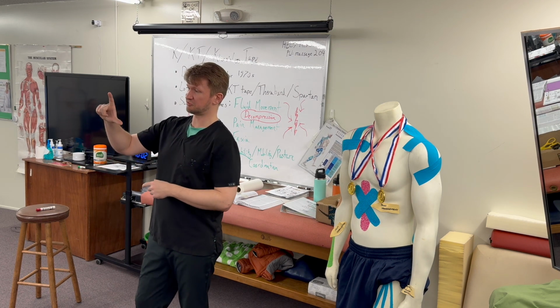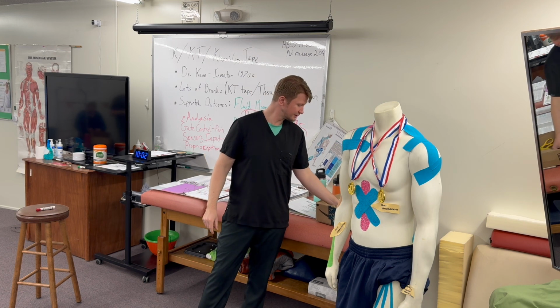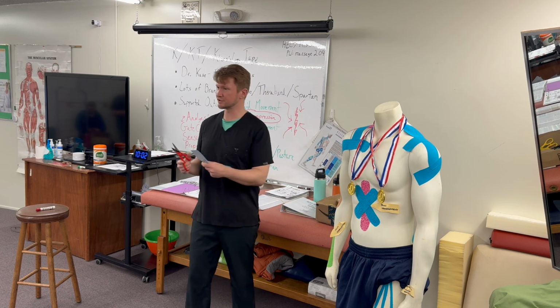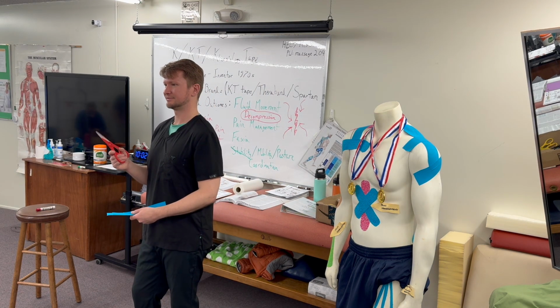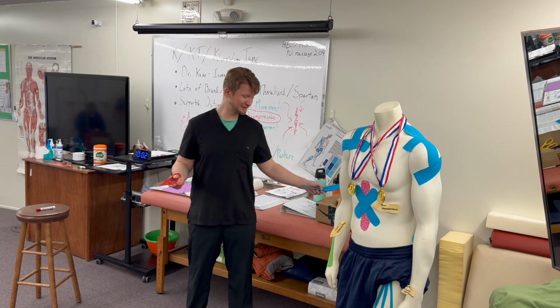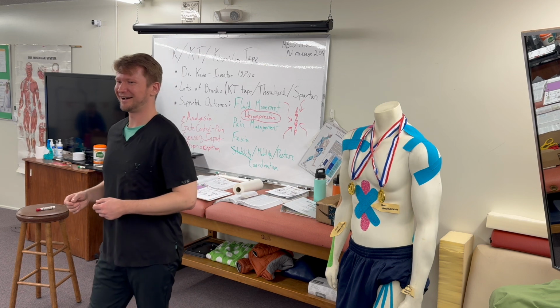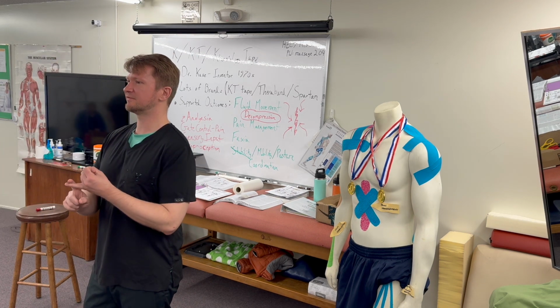And also, these are kind of short. A longer scissor, when you're talking about something, is about 2 inches. You get a much cleaner cut. I have a pair in my truck of actual trauma shears. If you want to practice with them, okay. They're really nice. So if you're doing this a lot, get the good ones, because these are one-time investment things.